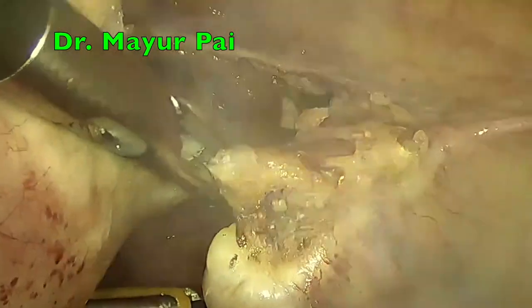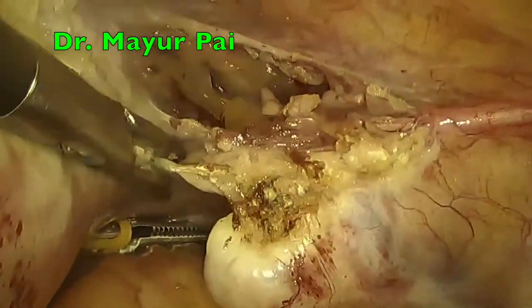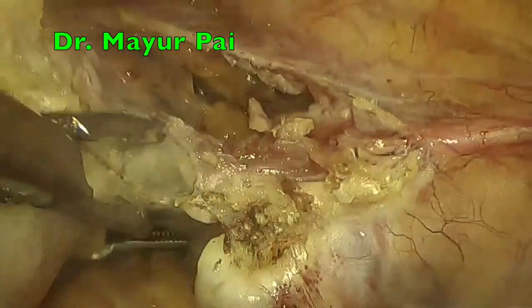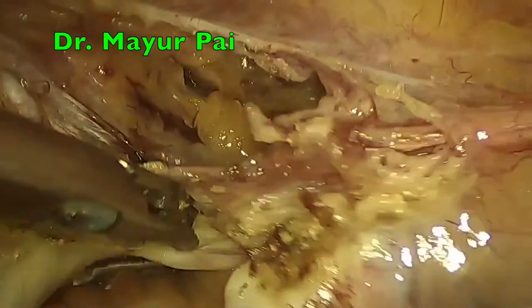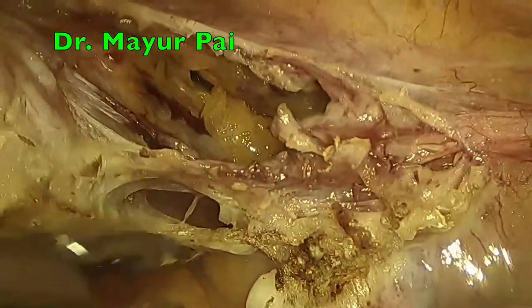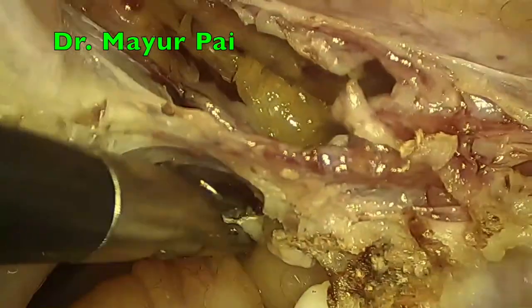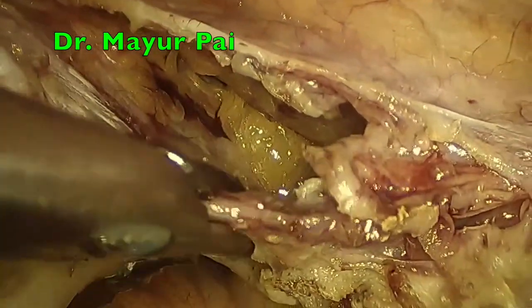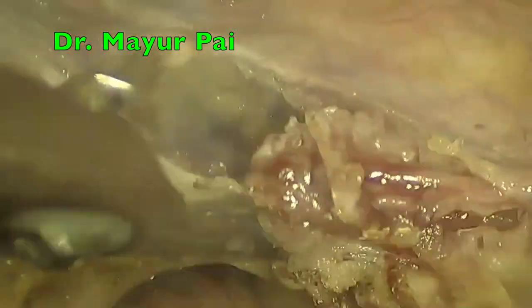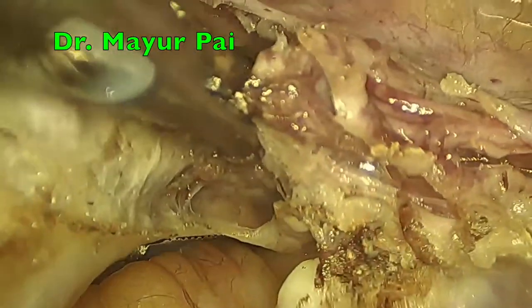We typically use a baseball diamond configuration in which we are using 5 mm ports, 3 in number, and the optical port is the 10 mm port. Now you can see that we have begun with the dissection of the posterior leaf of the broad ligament. We are removing some of the connective tissue here and there to get a better exposure of the uterine vessels.